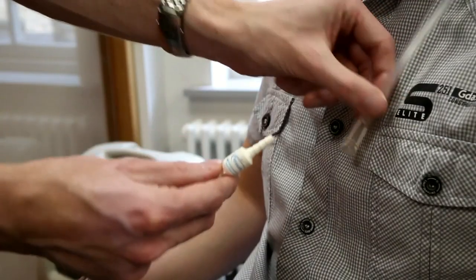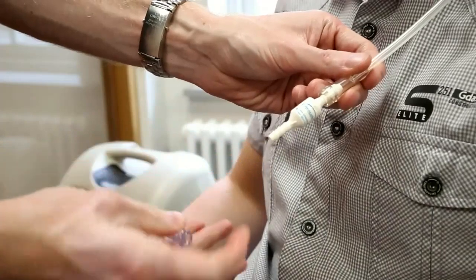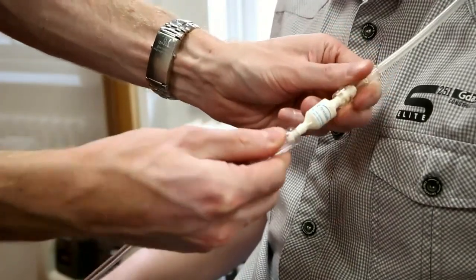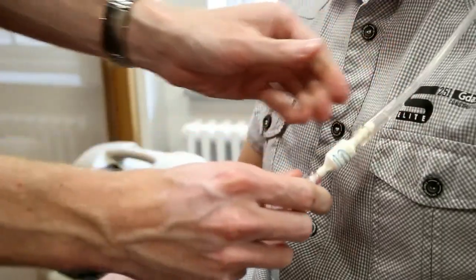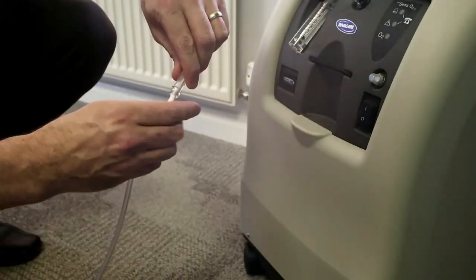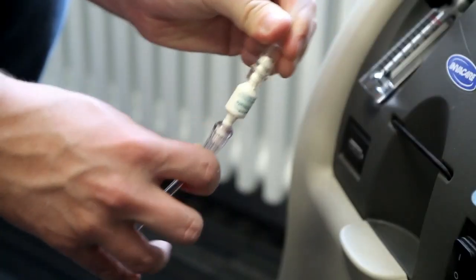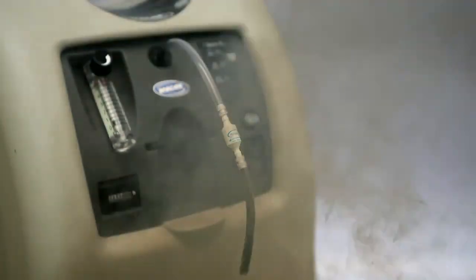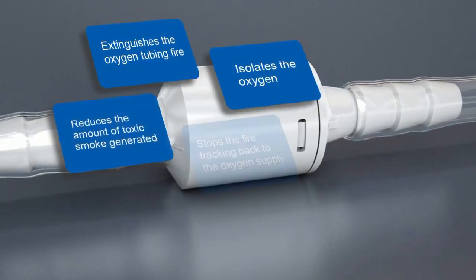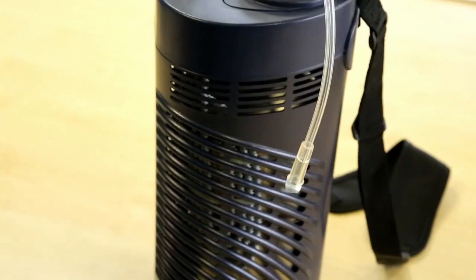Fire brakes satisfy both requirements. For optimal protection, at least two fire brakes should be installed in the supply tubing — one fitted close to the patient and one close to the supply. Fire brakes extinguish oxygen tube fires and isolate the oxygen supply. This reduces the amount of toxic smoke generated, stops the fire tracking back to the supply, and significantly reduces the risk of a large structural fire developing.